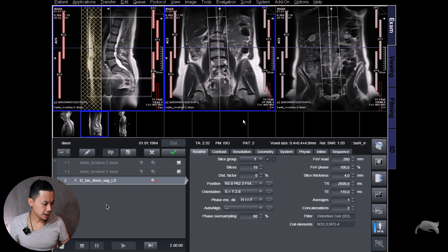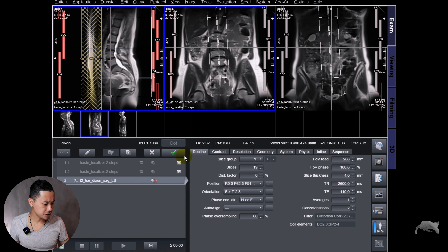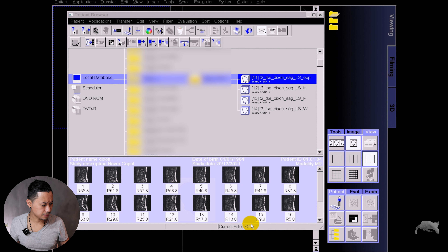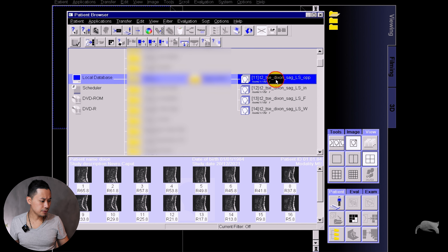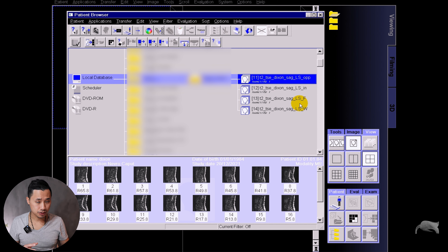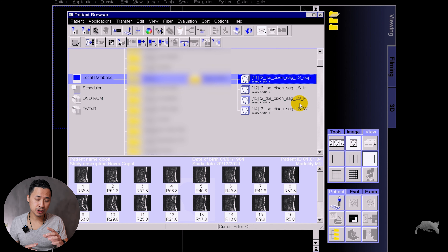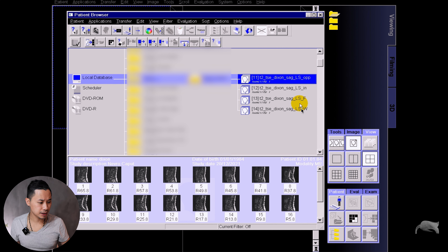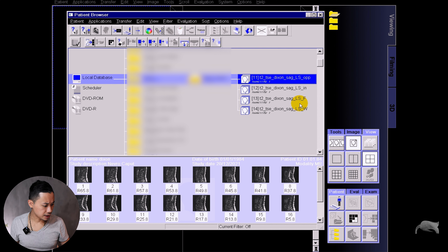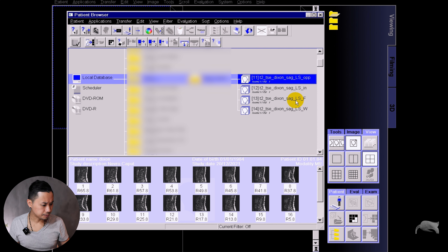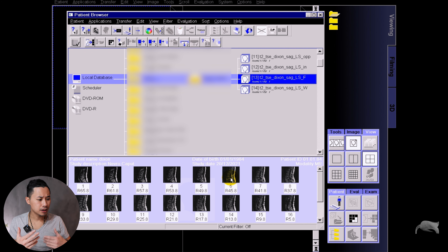We're currently on a three tesla scanner, but it doesn't matter — you can do this on 3T or 1.5T. In front of you here you have a 2D turbo spin echo Dixon. I'm just going to position it for an LS spine and apply that to get some images so we can do the fraction.